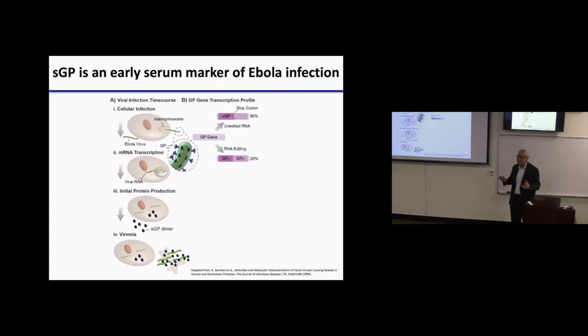It just seems crazy. The other test that's available on the other end is a lateral flow assay, which has horrible sensitivity. I won't show you the data, but we've actually built our own LFAs. Our assay is like 100 to 1,000 times more sensitive. But it's approved, but it diagnoses it very late, by which point people are so sick they're going to die. And now that we have antibodies available against Ebola, it turns out the sooner you diagnose, that antibody that Tony Fauci just published works.